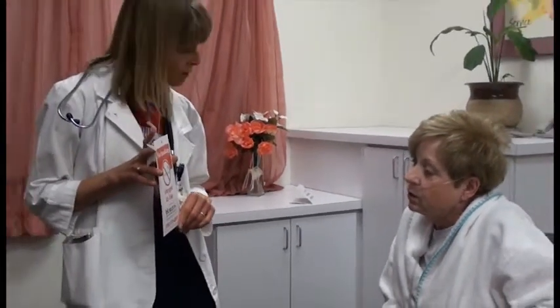Do you have a gas stove? Well, yeah, I was just going to make some lunch. I got my soup here. You wouldn't want to have your oxygen going while you're making soup. Just take it off for a minute. Do you have a microwave? Yeah, I do. Well, that might just be the thing.